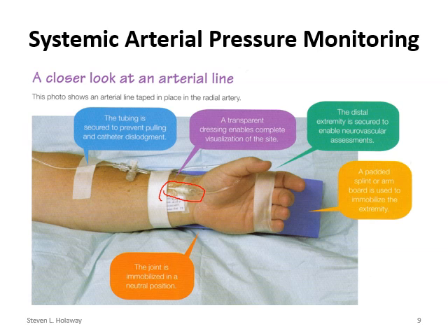Most of the time you'll see the nurses wrap the tubing under the thumb and come back out with it. That's just so that there's no direct pull on the tubing itself. Most times the tubing is secured not only before but also after the stopcock. The stopcock is where we're going to draw the blood from. It's a three-way stopcock, and this is again where we're going to draw the blood from for this patient.